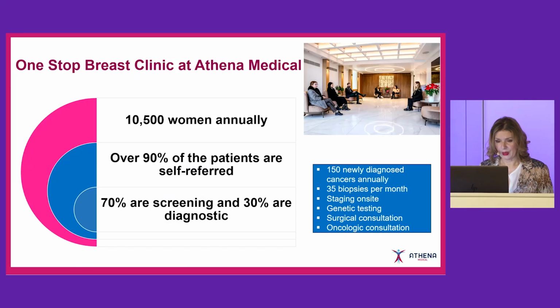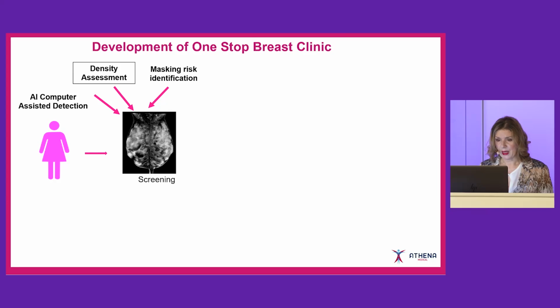And we evaluate about 10,500 women in our one-stop breast clinic, which was founded 3 years ago. Over 90% of these women are self-referred, approximately 70% are screening, and about 30% are diagnostic patients. And it is very interesting to see the workflow of our one-stop breast clinic. It means that whatever is needed is done on the same day, without any waiting list or without having the patient coming back and forth.